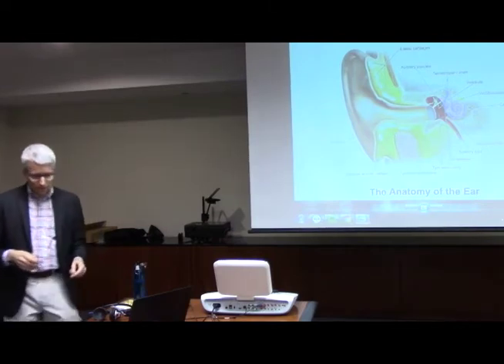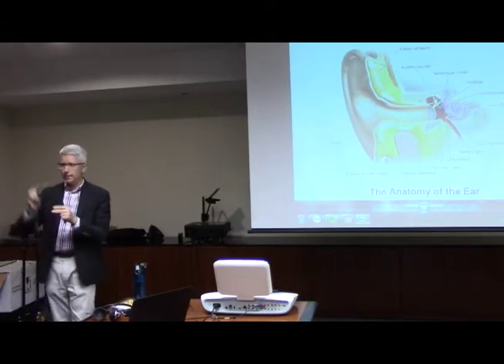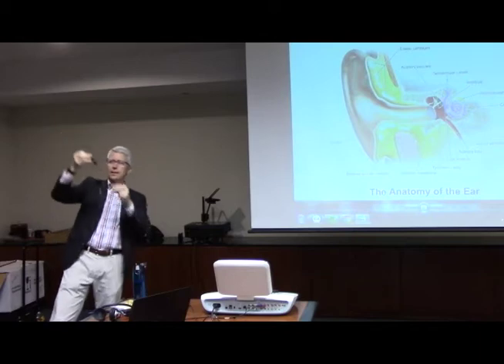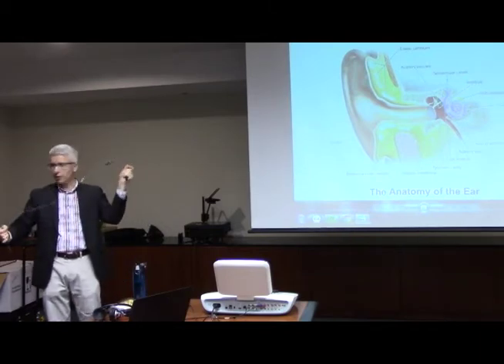Now, there's another one, bone conduction, which is this guy right here, which has the bone oscillator, headband, and a cord, all of which, again, yes, we have.